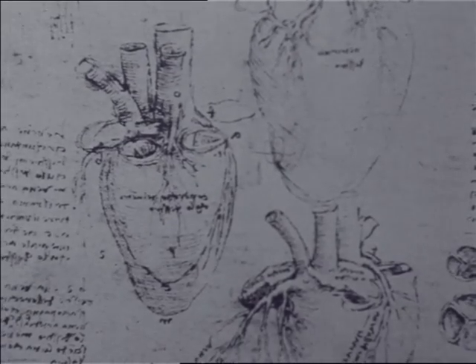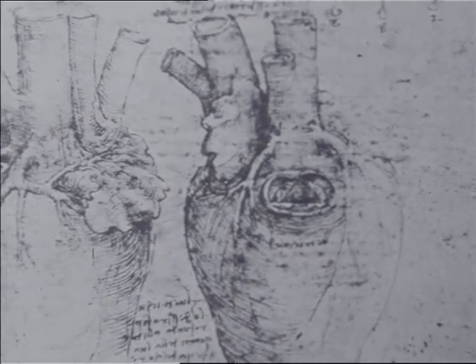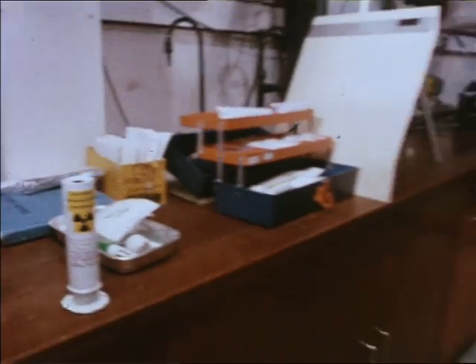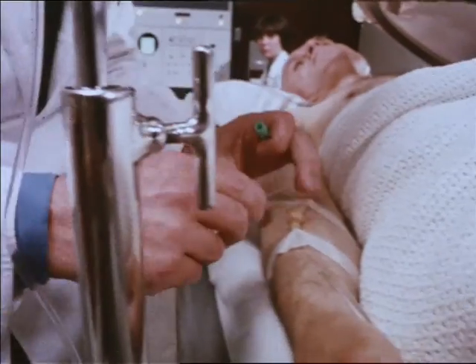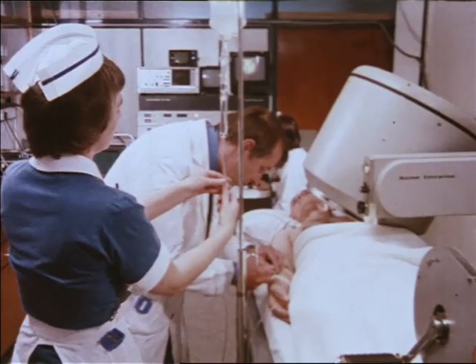An investigation carried out with the naked eye which continues today. But now we look without having to dissect, for we can see inside the living body. This is the human heart at work, seen with radioactivity. Okay, could I have the isotope now, please? The technique developed at the Royal Edinburgh Infirmary uses a minute injection of a radioactive substance. Gina, I'm making the injection now. Flush now, please.